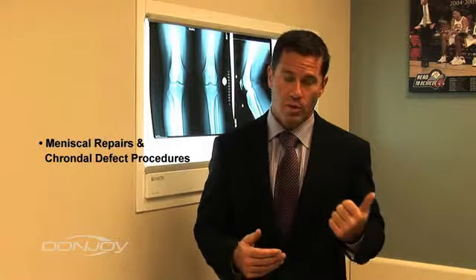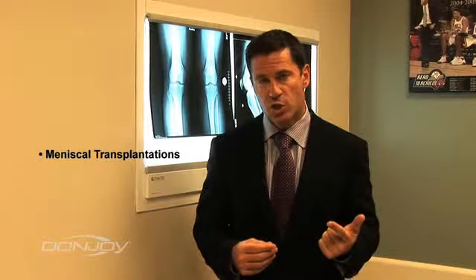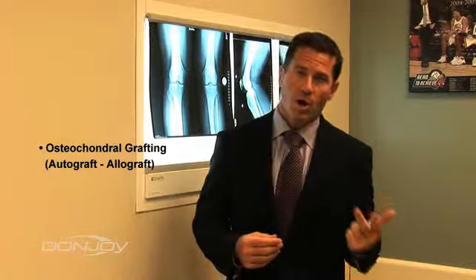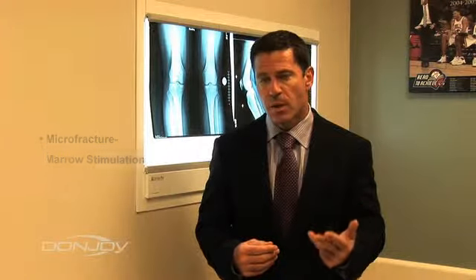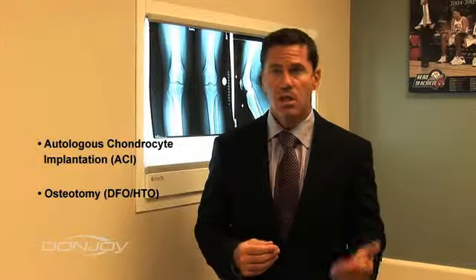The basic indications for this brace is to utilize it postoperatively following procedures of the tibial-femoral joint that would include meniscal repair, meniscal allograft transplantation, osteochondral grafting, whether it be autografts or allografts, microfracture or marrow-stimulation procedures, autologous chondrocyte implantation, distal femoral or high tibial osteotomies. These are basically unicompartmental procedures of the tibial-femoral joint that all have the same things in common.